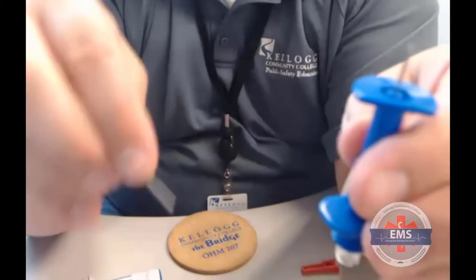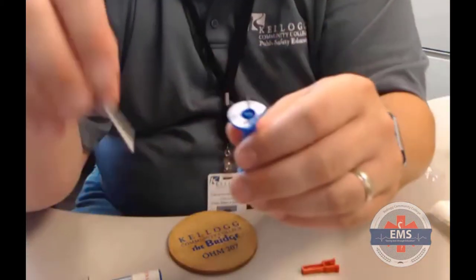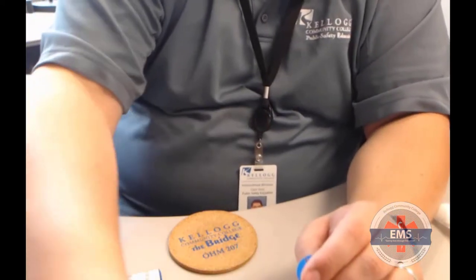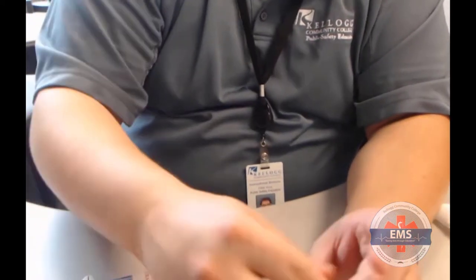You can also see when you hear it discharge, that ka-chunk that it makes. That's a big concern, because that could be fracturing the bone. So placement really does make a difference.